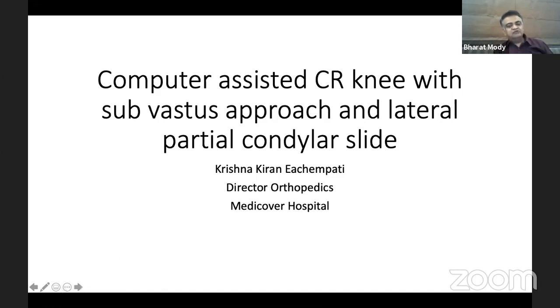In a varus knee, you have huge bone loss. I agree. So hyperextension is something that is a very different type of problem. It's not just a bone loss problem. So I'm just trying to get an opinion, because I've had this experience in the past, where on table it looked to be good because I filled it up, and yet it would deteriorate as time passes by.